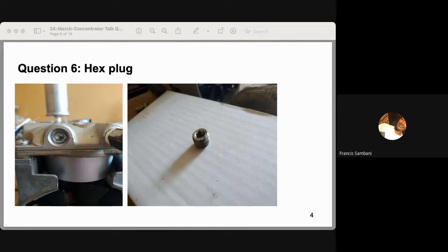An easy test for this compressor might be to connect a pressure gauge on the exhaust of the compressor and then block the relief valve. As you can see on the graphic, we have a hex plug. In the first picture on the left, you have the hex plug inserted. Of course, it isn't inserted where the relief valve was, but that was just for you to see how it can look when on the compressor. You unscrew the relief valve, and then you screw in the hex plug. That will block the outlet where the relief valve was. Then you can power on the compressor and read the maximum pressure showing on the pressure gauge. Then you should compare the maximum pressure at zero flow with the one given in the performance chart of the compressor.